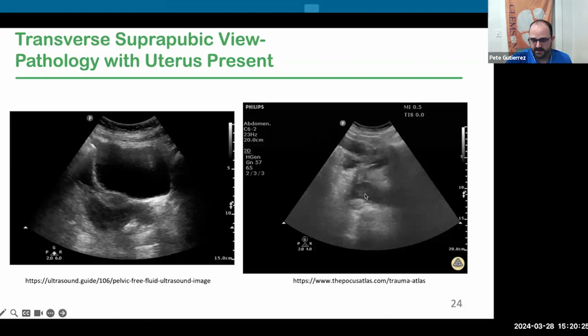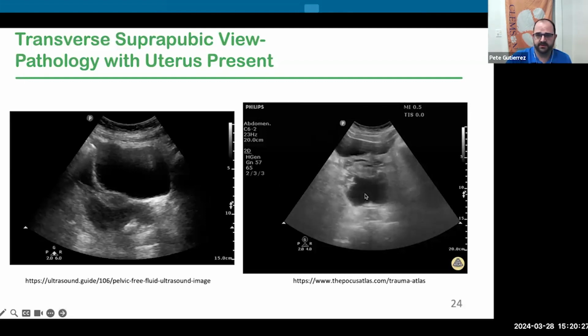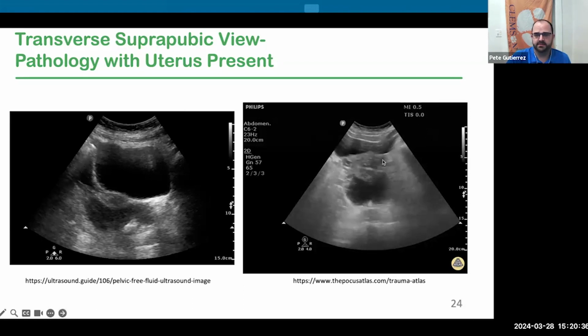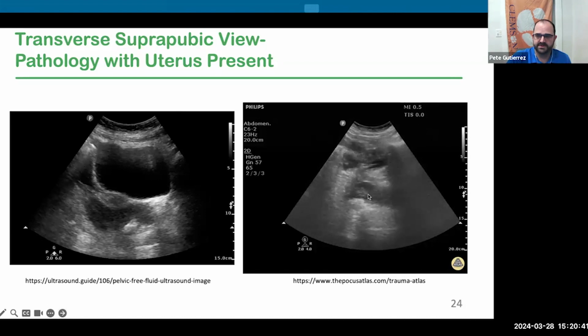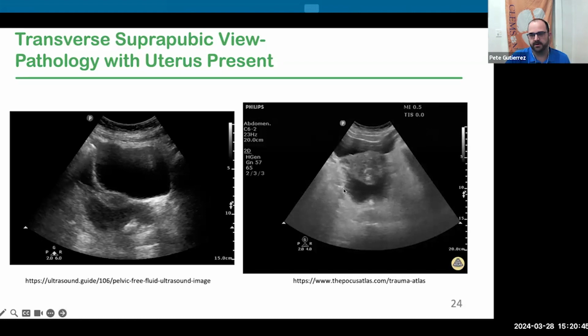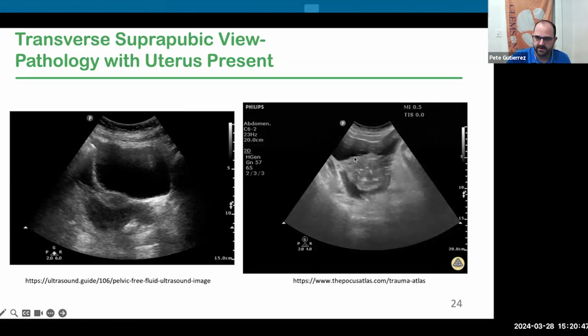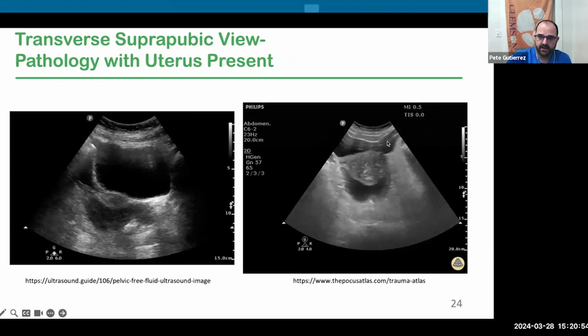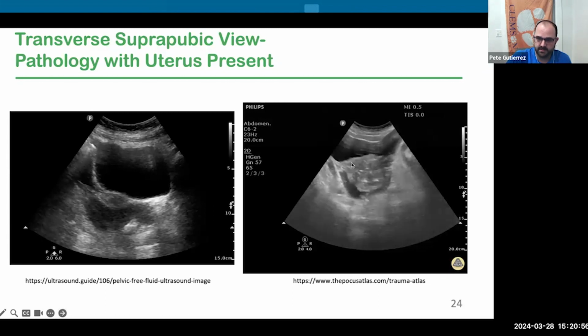This over here on the right side is a special situation called a TIE fighter sign, referring to the Imperial Starfighter ship from Star Wars. This is one of those instances where there is so much free fluid in the abdomen that is both anterior and posterior to where the uterus is, and then the suspensory ligaments of the uterus are holding it up at the very edge of the image, not here, but right there. That's where the bladder is. So this is not bladder, it's coming right at the end of the image right there.